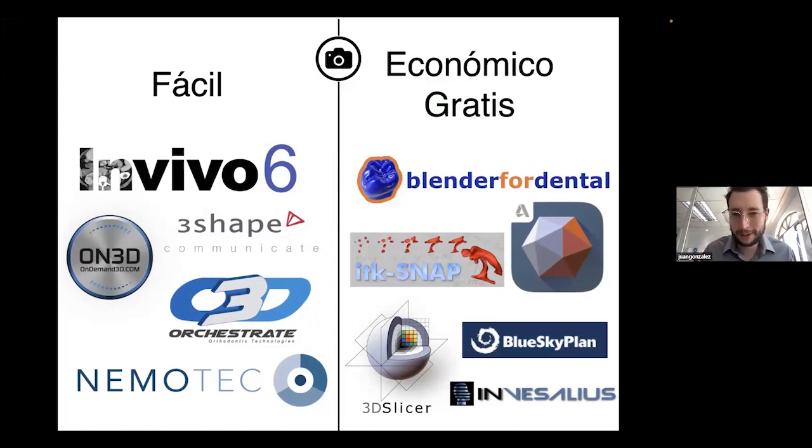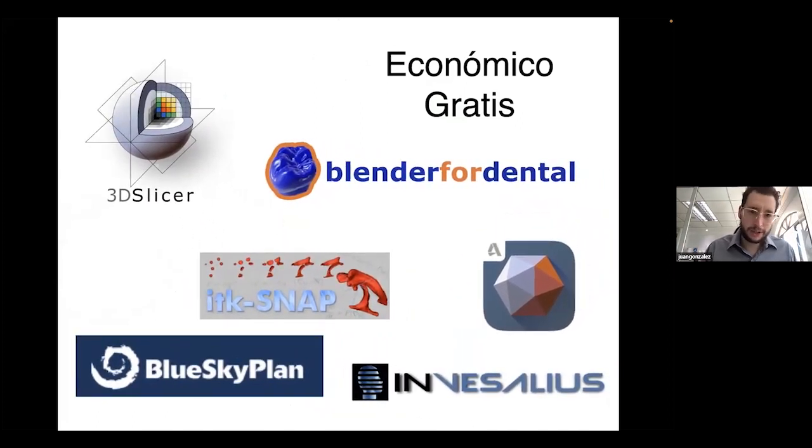So I divide the screen into 2 different options where I think we can be. On the left side, those softwares which are simpler to use, but a lot more expensive. And on the right side, those softwares that can be less expensive or even free, but usually they demand more understanding of the procedures, more understanding of how the 3D world works, and let's say a steeper learning curve, right?